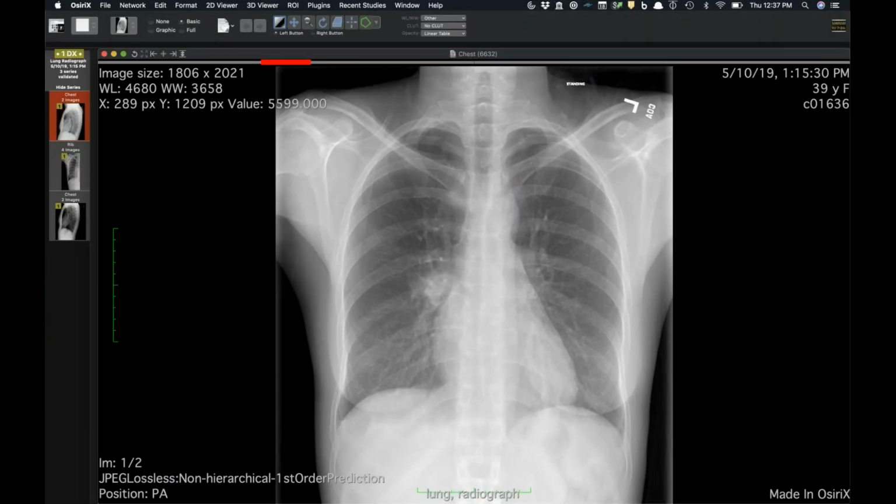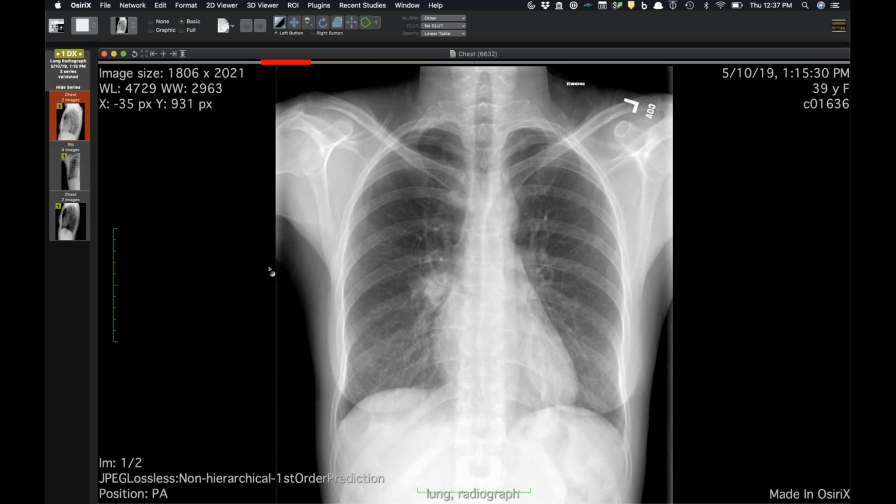Now this is one that I've titled as the most useful rib series ever. I say that in a joking way. Jeff is laughing because we both write for the appropriateness criteria. One of them is on rib fractures that I've authored, and of course there's really no data to use rib series for the evaluation of rib fracture. But I think in this case it is very helpful.